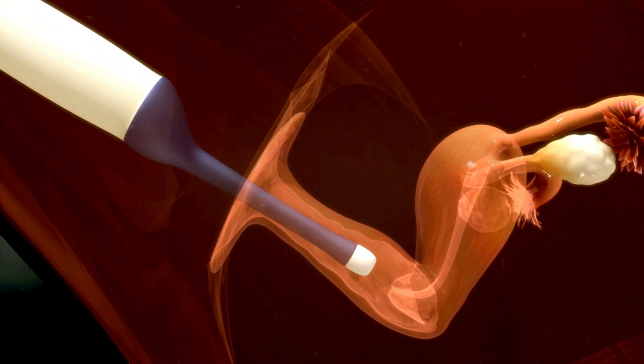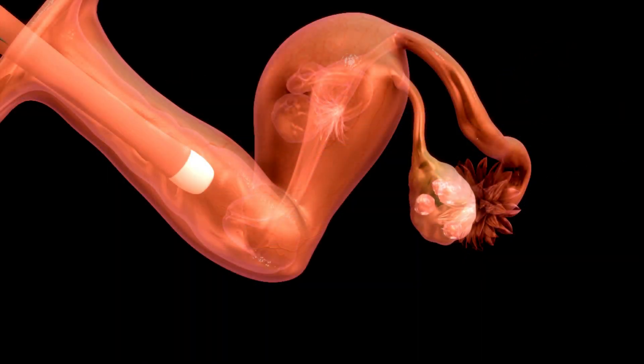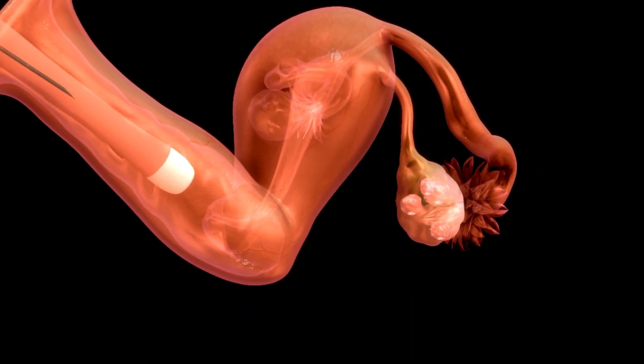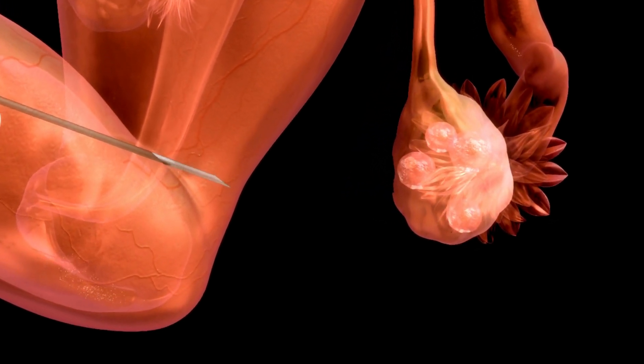The procedure involves puncturing the ovary with a needle, guided inside the follicles using ultrasound vision. The doctor will use an ultrasound to locate your ovaries then inserts a needle into an ovary, connecting it to a suction device and test tube.